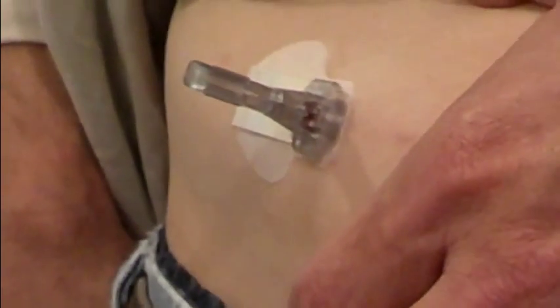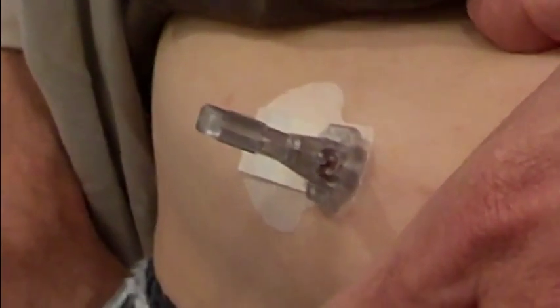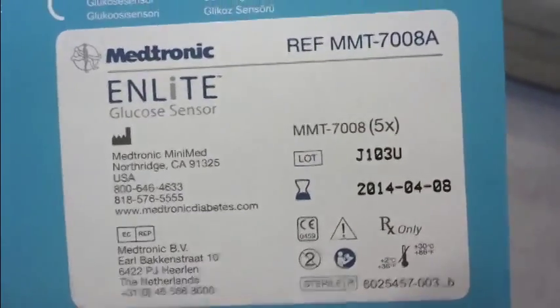This isn't an isolated incident. This is at least the third, more like the fourth or fifth time this has happened. Both of these boxes contain five of these sensors. I have finished one box and I've got one sensor still in the box, and I've got one sensor that's not working properly in my abdomen. So that's where I stand right now.